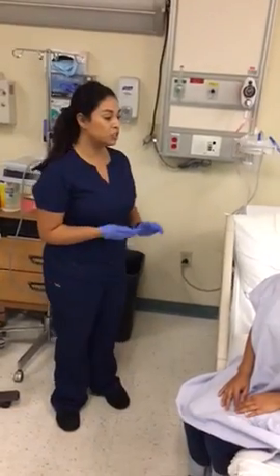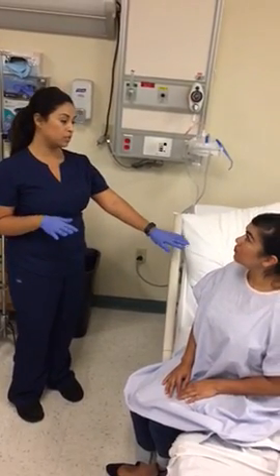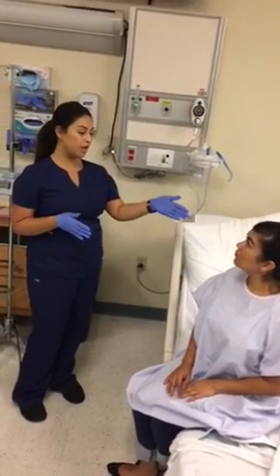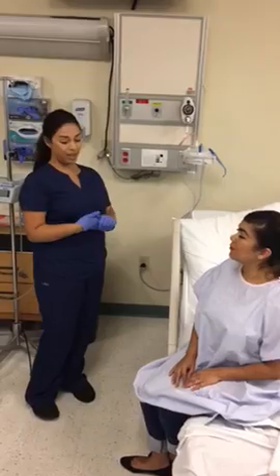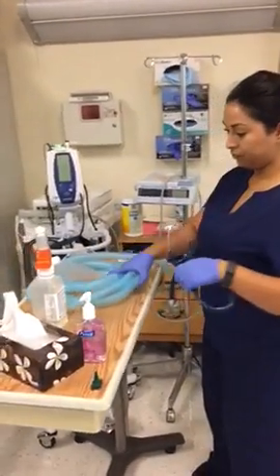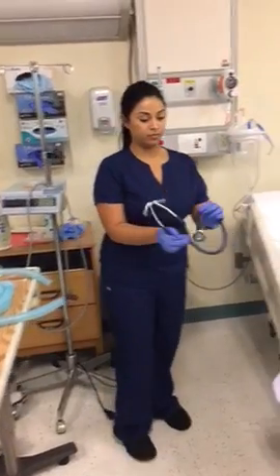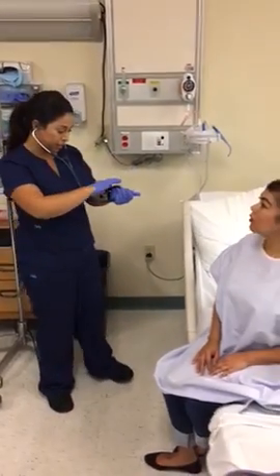Okay, next I'm going to be checking your breath sounds. I'm going to start from the back, at the bottom of your back, and work my way up. I'm also going to be listening to your neck and a little bit of your chest area. Okay. So I'm going to go ahead and get that ready. When I place my stethoscope on your back, I want you to take a nice deep breath, okay? Okay.